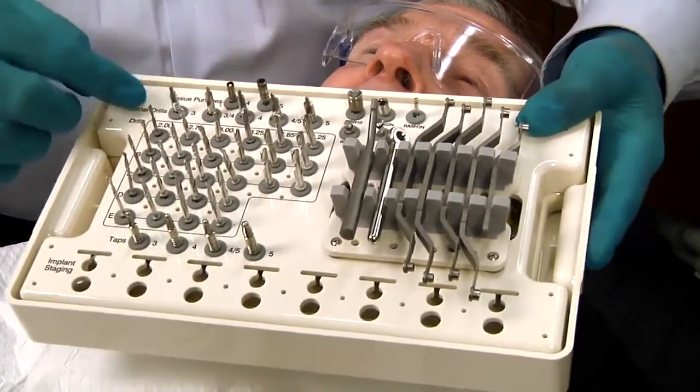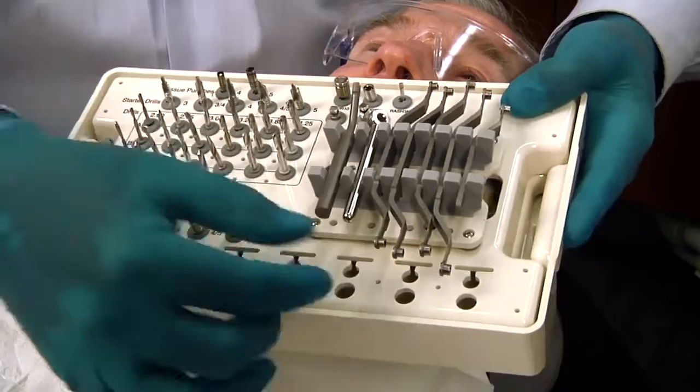They have the taps, the tissue punch, the starter drills, and then the sleeves.